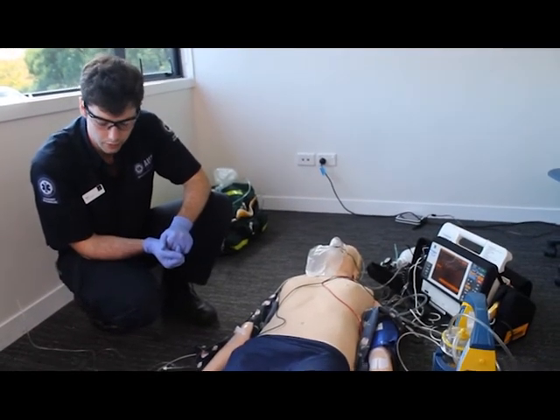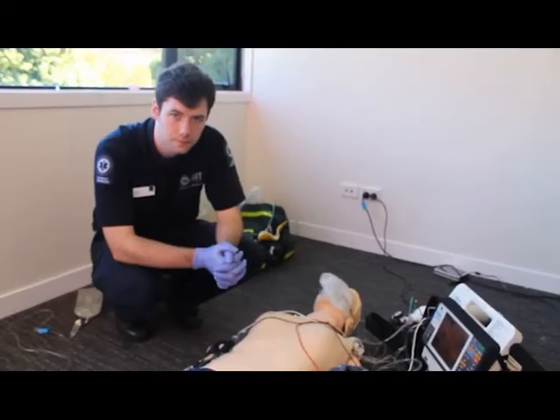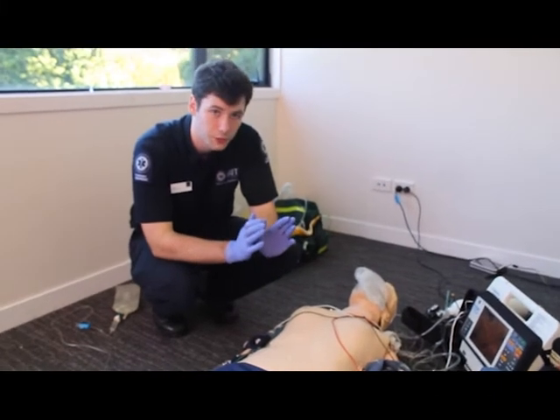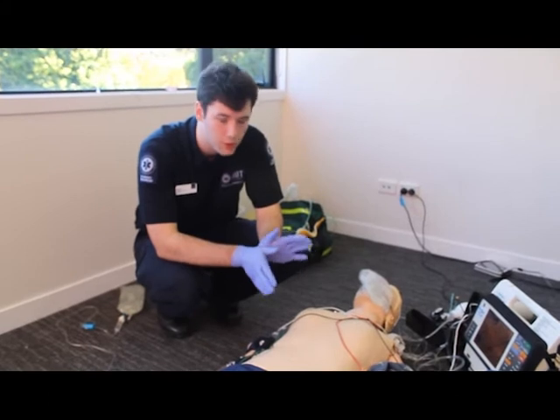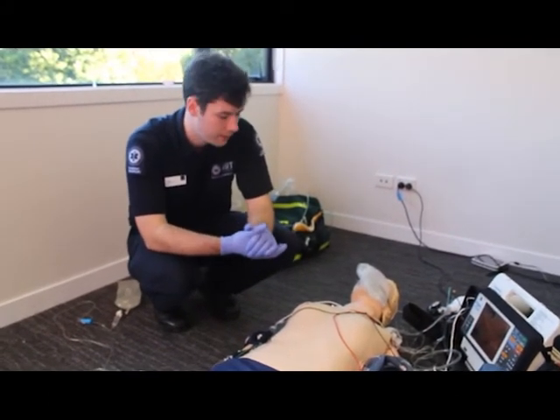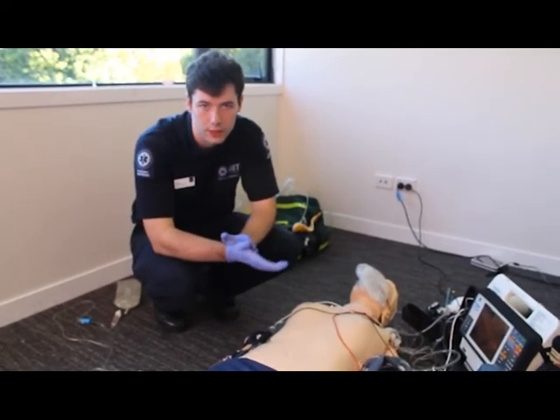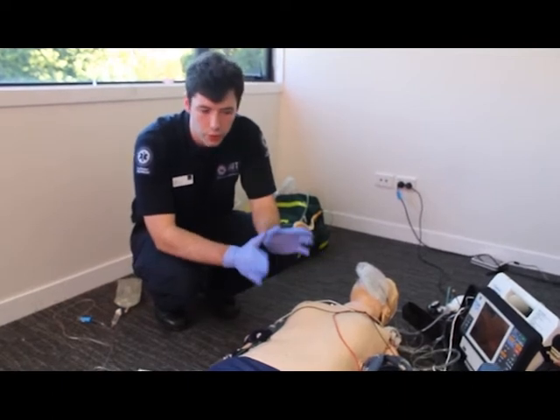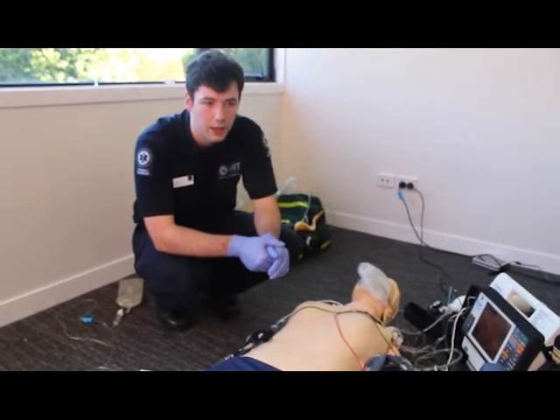And then we've gone through our RSI preparation checklist. It's not uncommon for RSI to fail, and in the case of a failed RSI, we want to follow our failed intubation checklist, or failed intubation drill rather. If the ICP can't visualise the chords of the patient within 15 seconds of laryngoscopy, or has not intubated the patient at all within 30 seconds of the first laryngoscopy, then it's considered a failed intubation.